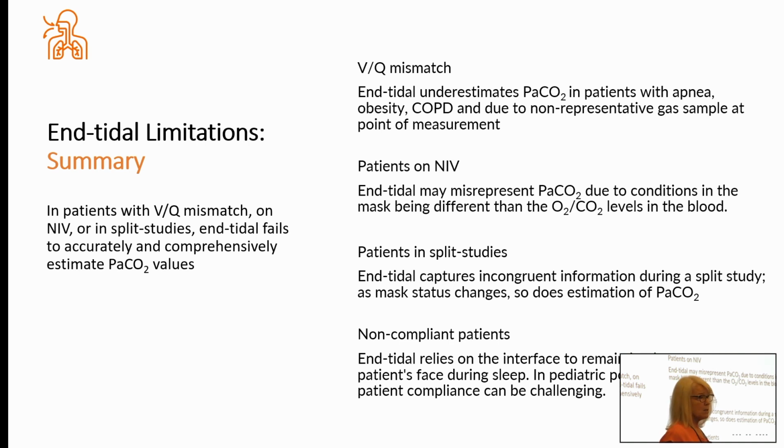We need to be aware of these changes when evaluating an overnight report in order to determine the patient's treatment plan. So I talked a little bit about those non-compliant patients, but end-tidal monitoring is always going to rely on that monitoring device to remain in place for an accurate value.